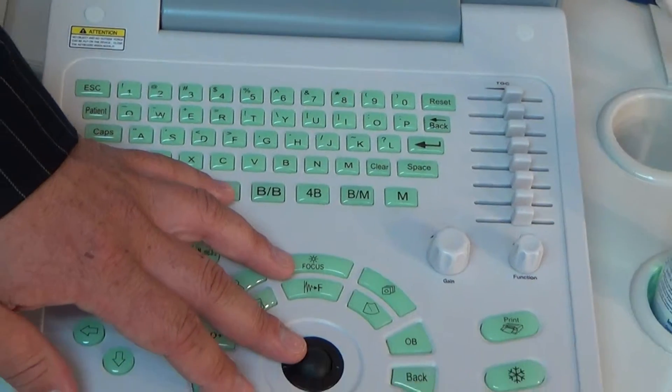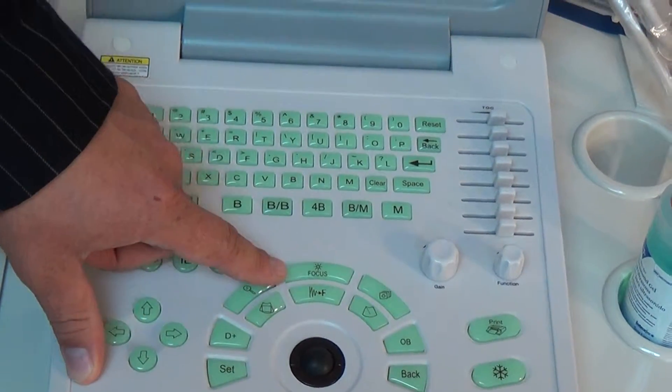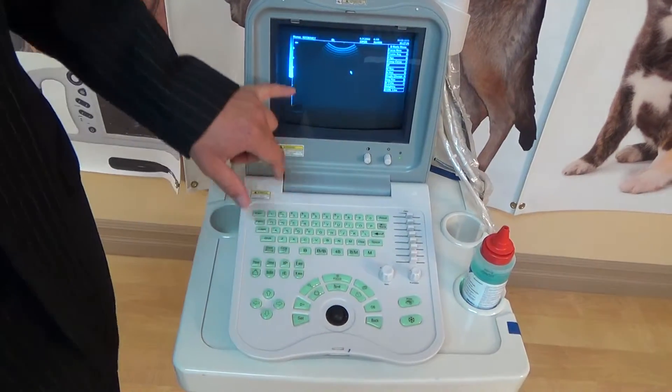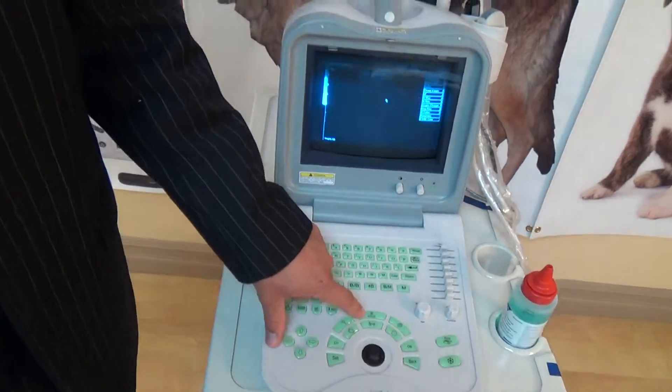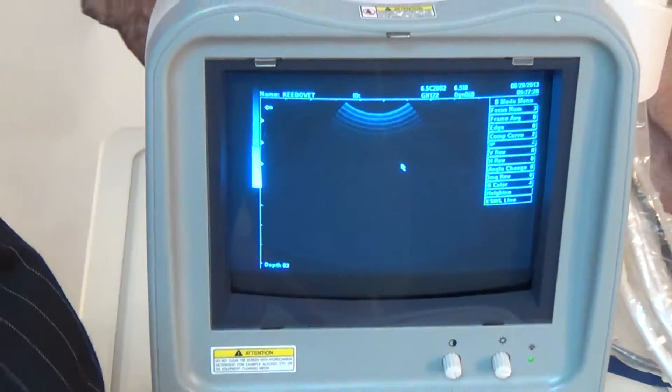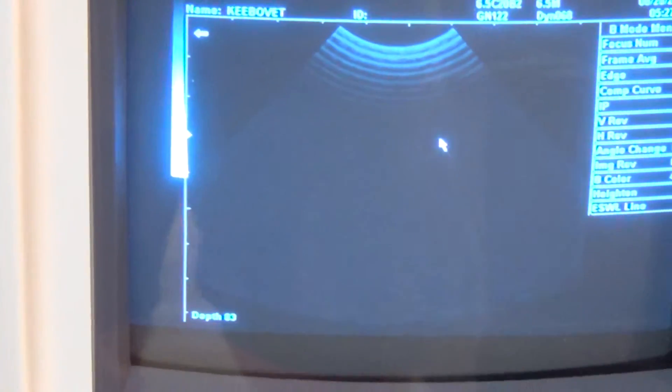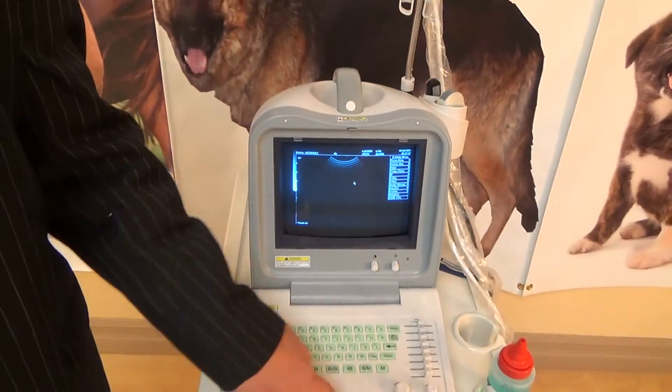These buttons — and specifically Focus — are essentially self-explanatory. That adjusts the number of foci that you see on the screen. So we start off with 1, you can have 2, 3, or 4, and we can adjust the height of those depending on the number. With the keys I can move it up and down, and with the Focus button I increase the number.